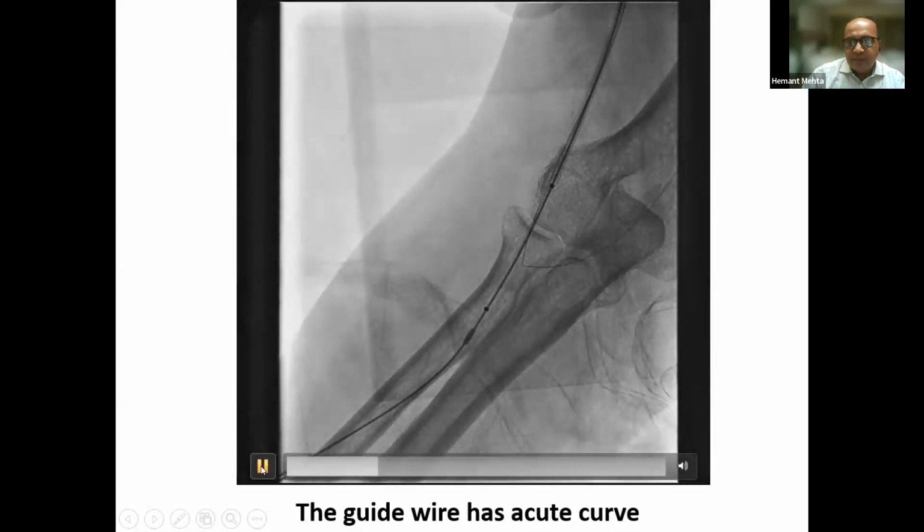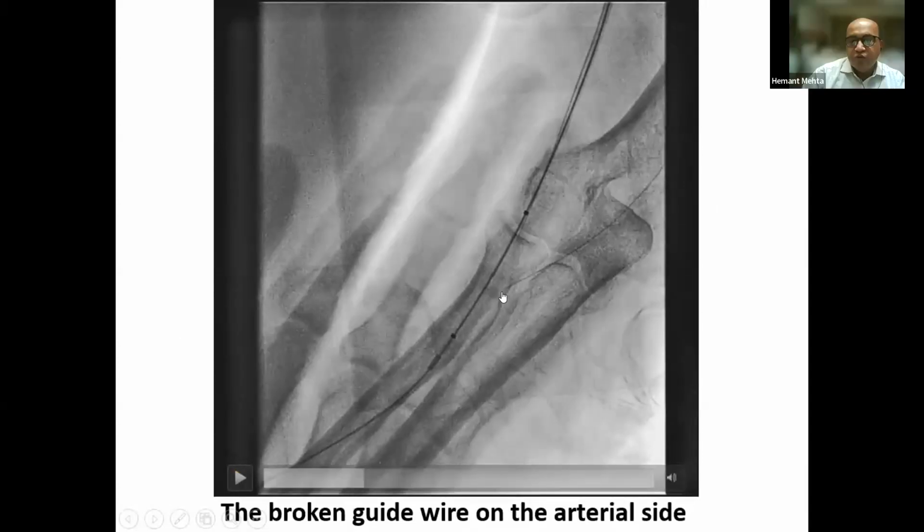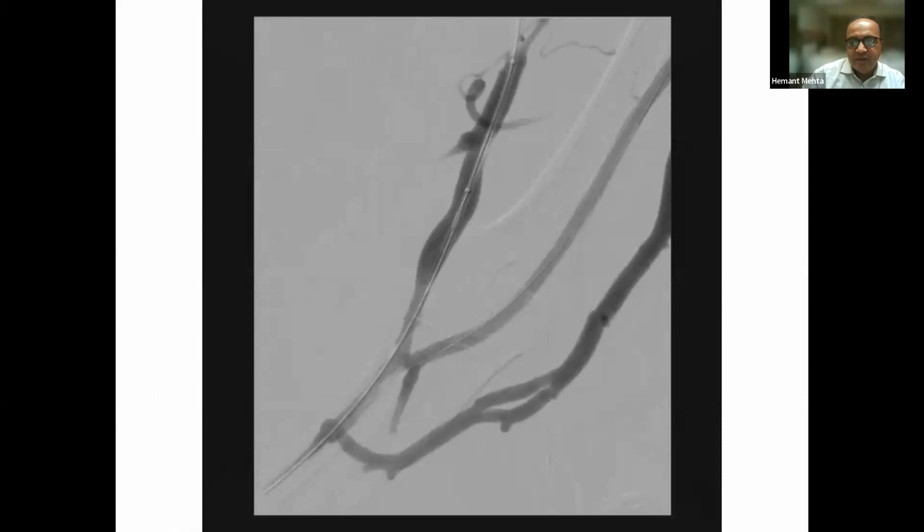Now see what happens. The balloon is inflated, and one of the assistants, this is the action, pulled back the balloon without deflating it. And the next thing we realized was, you see this? The wire is broken over here. So we said, let's finish it off. We finished off the angioplasty, and that was a tight lesion over there. We have got a good result over here. So this job is done, but with the broken wire lying there.